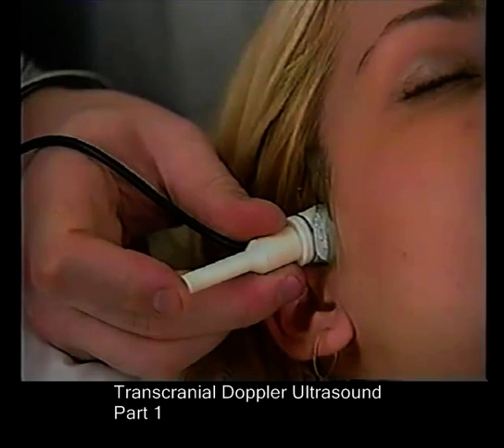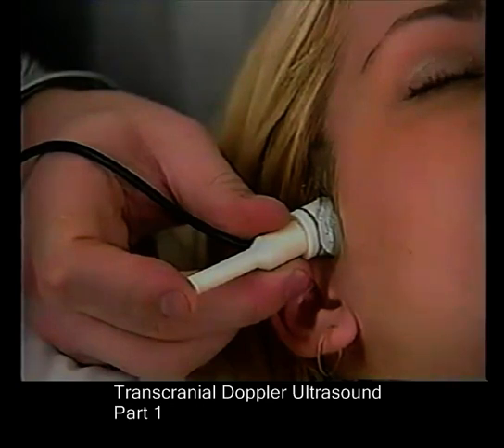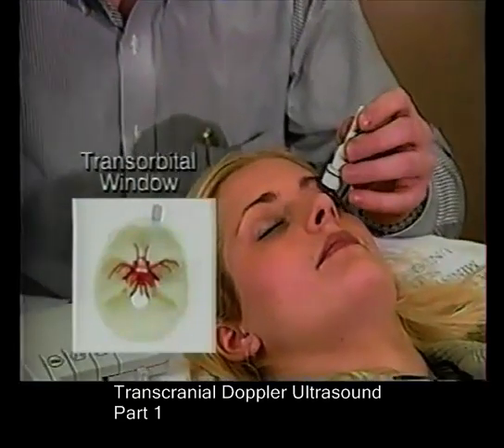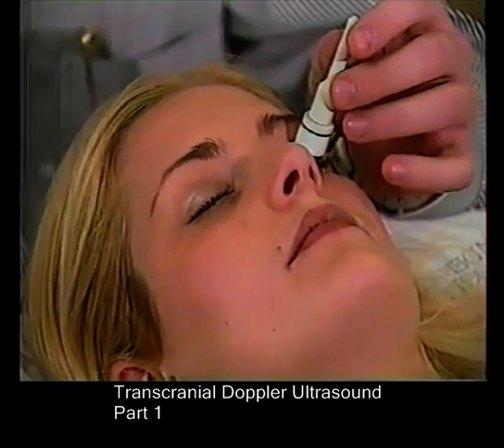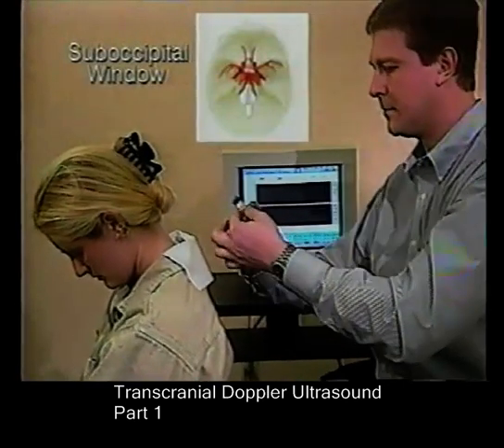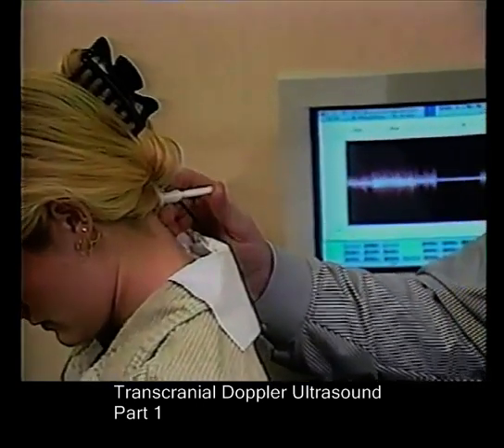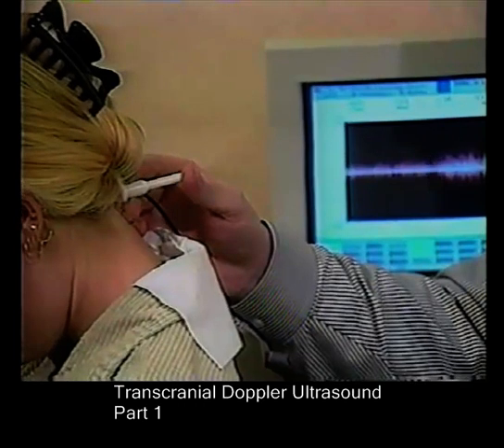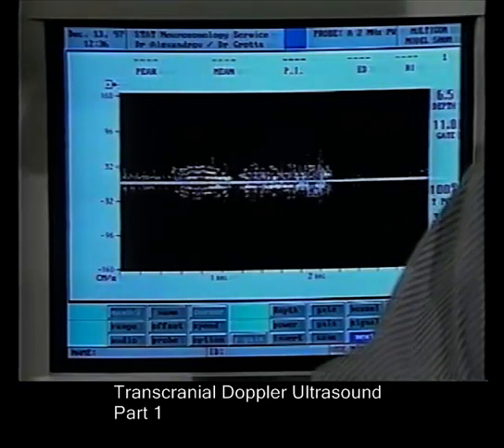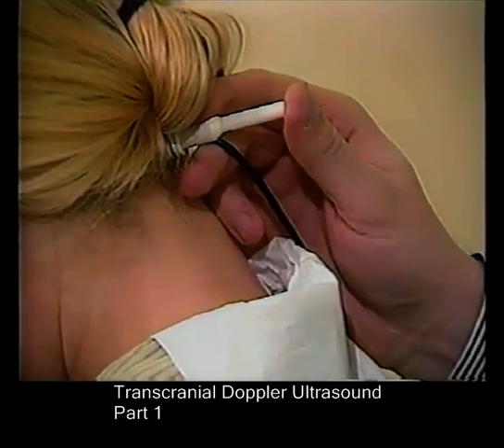The transducer is then aimed posteriorly to evaluate the P1 segment of the posterior cerebral artery, and this examination is completed on both left and right sides. The ophthalmic artery is accessed through the orbital window; increases in depth allow examination of the cavernous portion of the internal carotid artery and the ICA siphon. The vertebral and basilar arteries may be accessed from the suboccipital window, with the patient seated with head bent or from the supine position. The vertebral arteries are followed from the V3 segment to the basilar artery by increasing insonation depth, and the basilar artery may be followed from its origin to its more distal portions with incremental increases in depth.